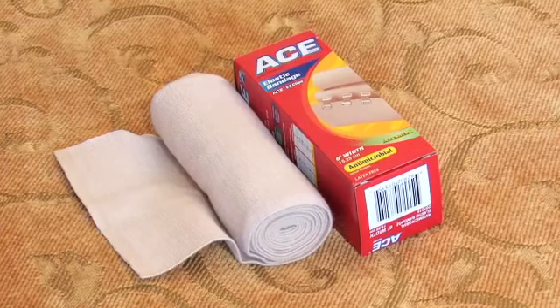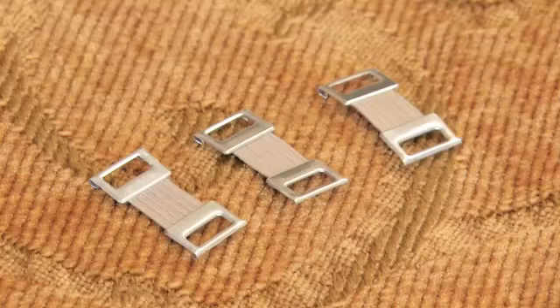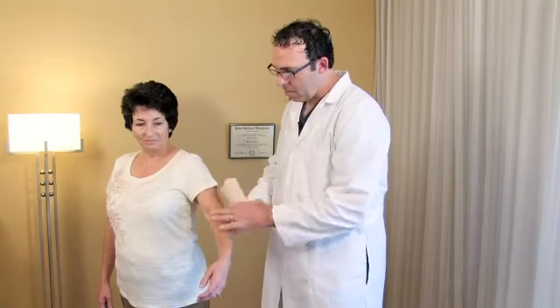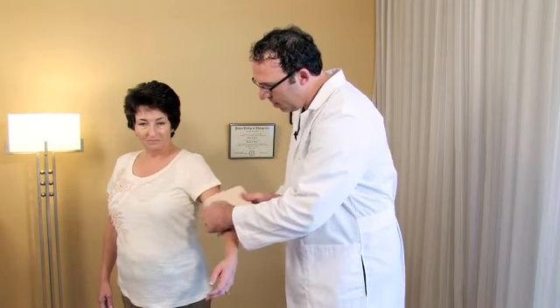You're going to start with a 6 to 10 inch wide ACE bandage wrap, and it typically comes provided with some metal clips that we'll use at the end to tape the bandage in place. Start with the patient's elbow just slightly bent, about 5 degrees or so on the inside of the elbow.